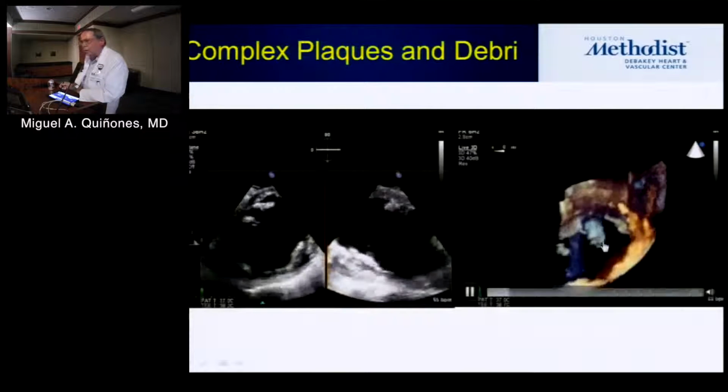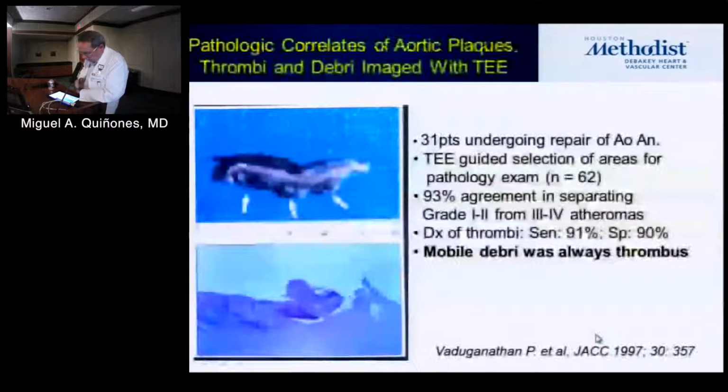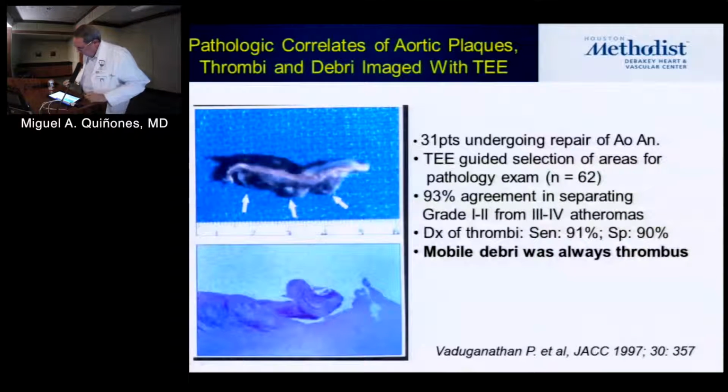I think this was done by you, Steve. I think I took it from you. Yeah. So 100 years ago, well, not quite, but in 1997, when Dr. Selby was a lot younger, this was a classic study that Nathan, who is now a grandfather, one of our fellows, did, where Dr. Crawford, I believe, was still alive, and when we made these diagnoses in the TEE room, he was kind enough to let us see what that was and send to pathology, and they were all thrombus.